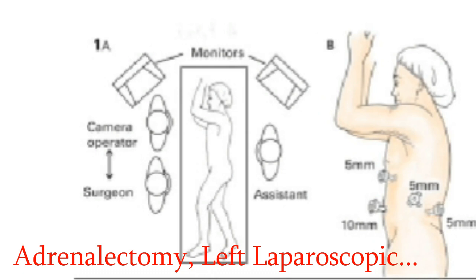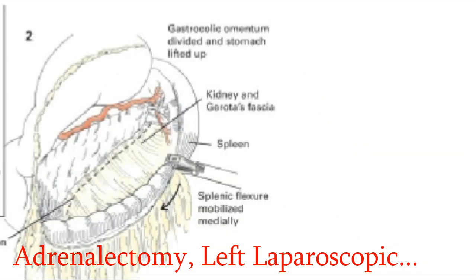Details of procedure — the operative exposure of the left adrenal is shown first. The splenic flexure of the colon is mobilized using an ultrasonic device so as to expose the kidney. The dissection is continued and the lesser sac is entered by separating the greater omentum from the splenic flexure and transverse colon.